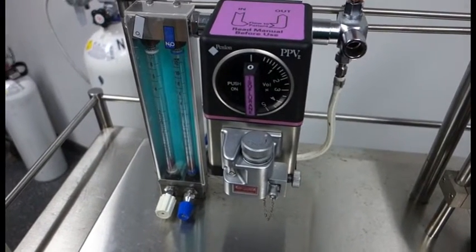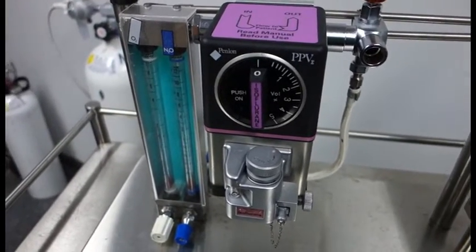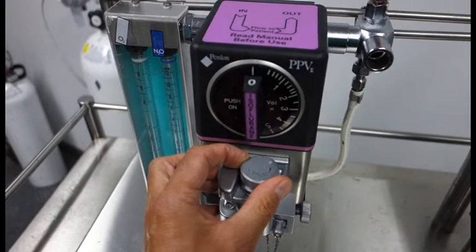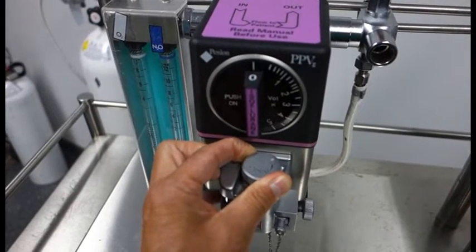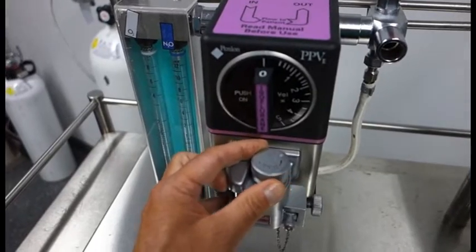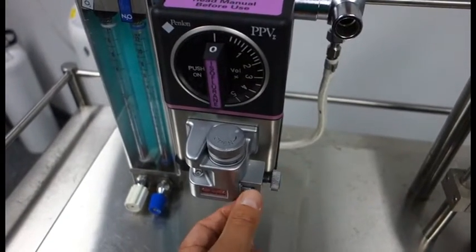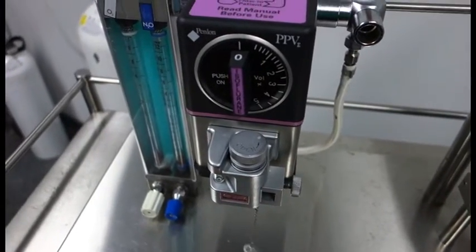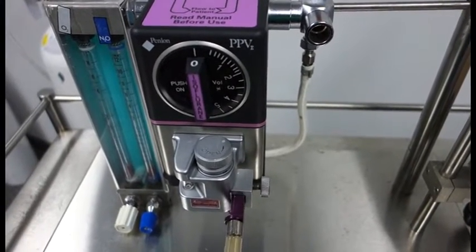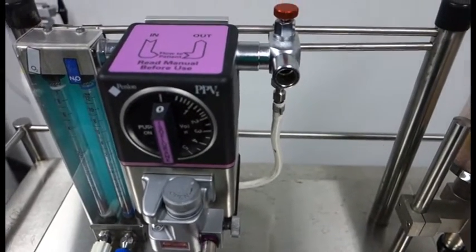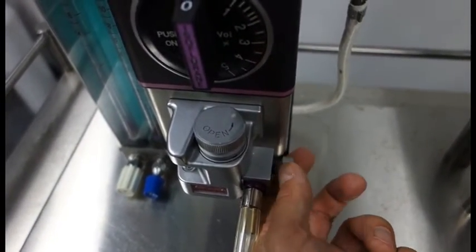Here we have our vaporiser mounted on the anesthetic machine. In order to fill this up, it's currently empty. We need to first ensure that this valve at the top here is turned to the closed position, so we turn that clockwise as far as it will go. We then unscrew this knob here on the side, and that allows us to take this slide out. That enables us to insert the keyed end of the vaporiser. It will only go in in one direction. Then we tighten up this screw here to lock that into place.